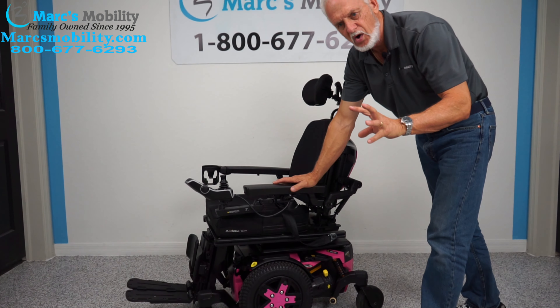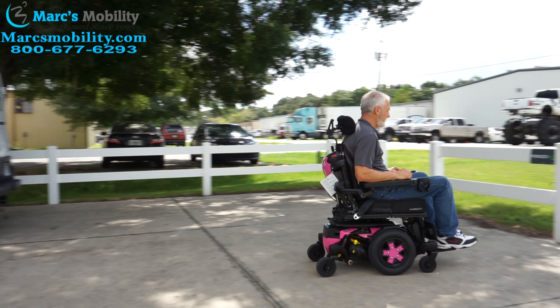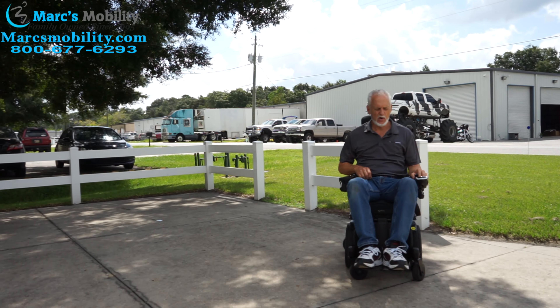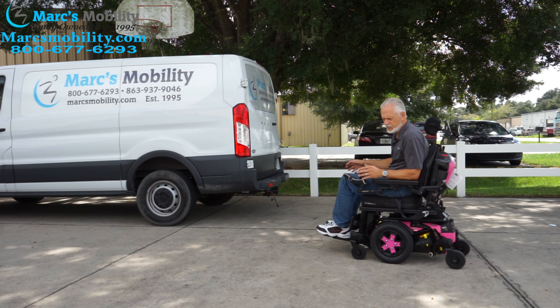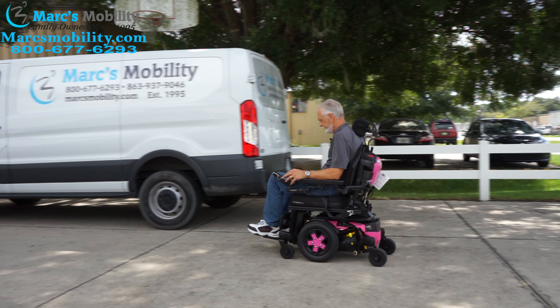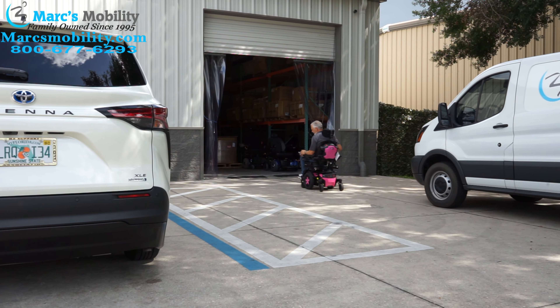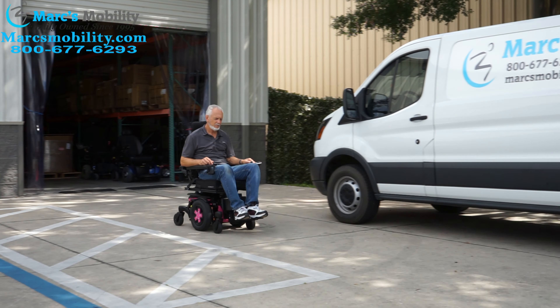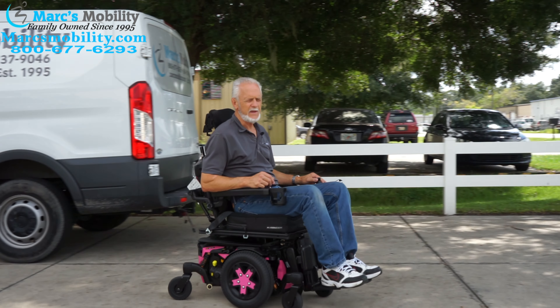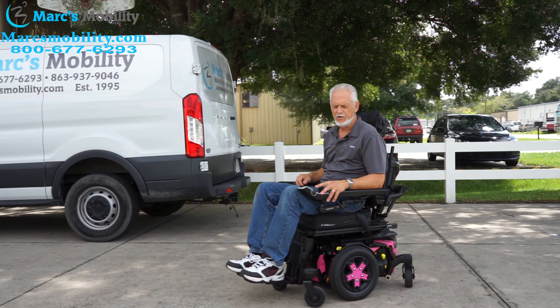If you're looking for a real small, top-of-the-line power chair, this would be one to look at. Top speed is 6 miles an hour. It's very easy to drive and very quiet.